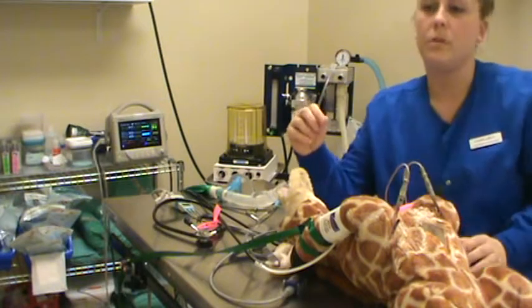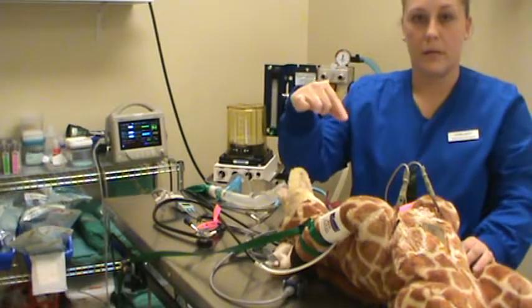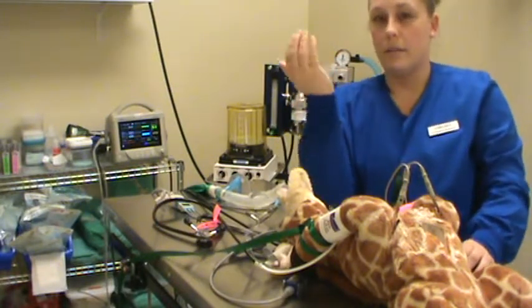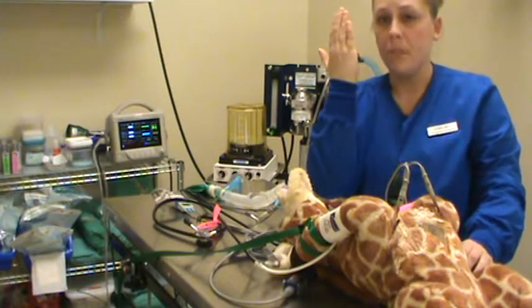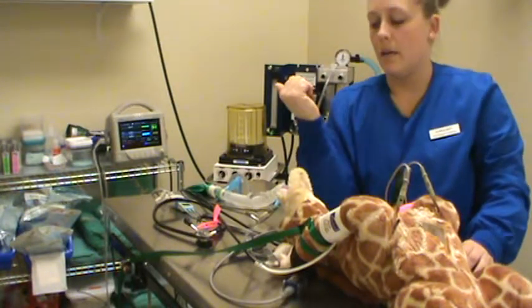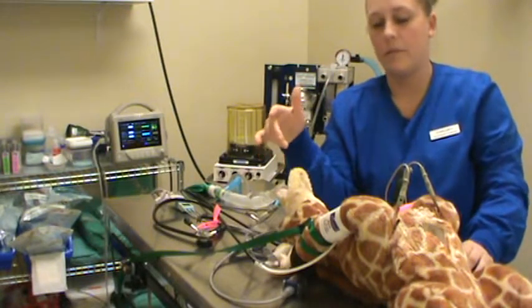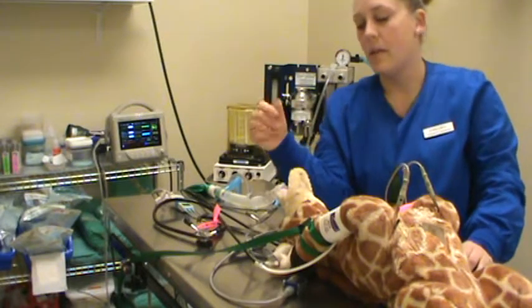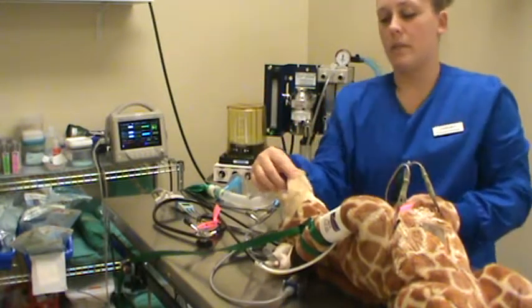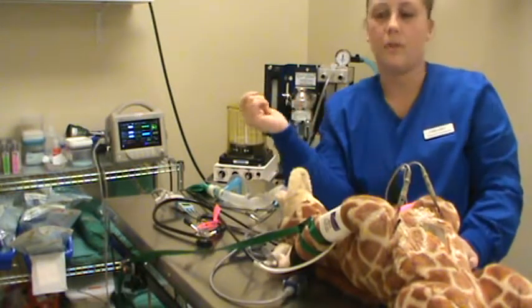Corneal reflex we don't use very often, but you take a drop of sterile liquid and drop it onto the eye, right under the cornea, and the eye is either going to stay where it is or sink back ventrally, just a little bit into the head, just kind of sink back. So we don't actually use the corneal reflex here very often because the other ones are really sufficient. Another one we can use here is the swallow reflex. You can pull on the tongue just a little bit, and if the patient swallows, they're too light.